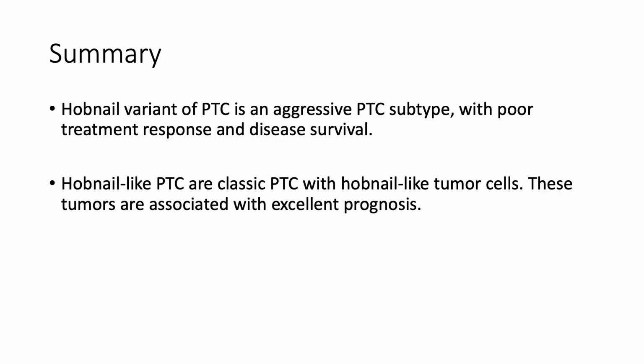Classic PTC with hobnail-like morphology is a mimicker. It is characterized by simple papillary architecture with edematous or fibrotic stroma, scant cytoplasm, no significant atypia or mitotic activity, excellent prognosis. Accurate distinction between these entities is crucial for treatment planning and prognostic assessment.